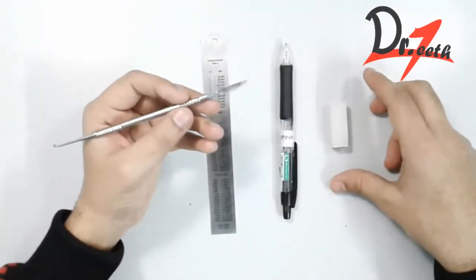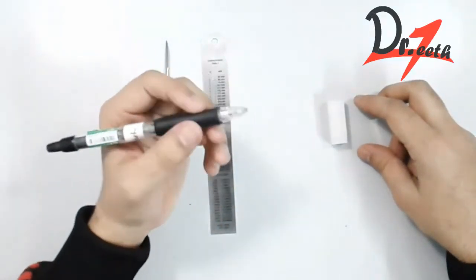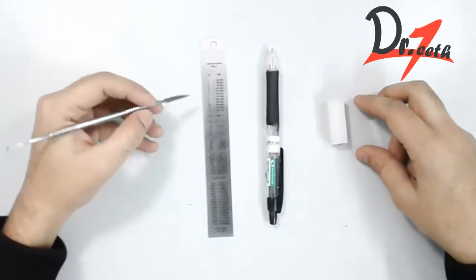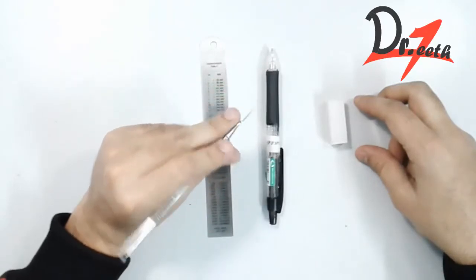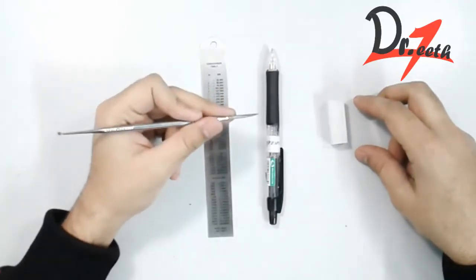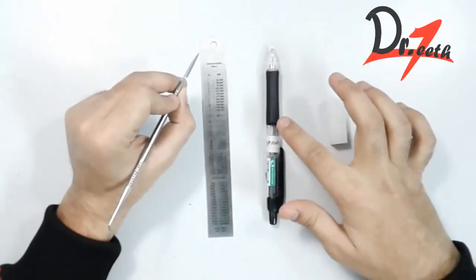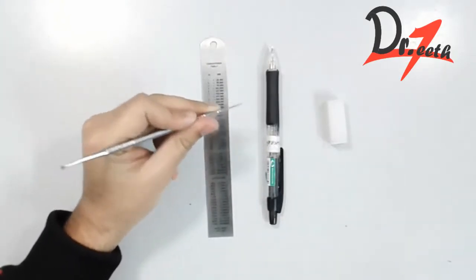First, I'll show you how to hold a carver. This is a pencil, and this is the pen grasp or pencil grasp. While holding the carver, this is the normal pen grasp, but when you move this middle finger forward, touching the blade or near the blade of this instrument, then it is called the modified pen grasp. This was how I hold the pen, and now this is the modified pen grasp, and with this grasp we will now carve.